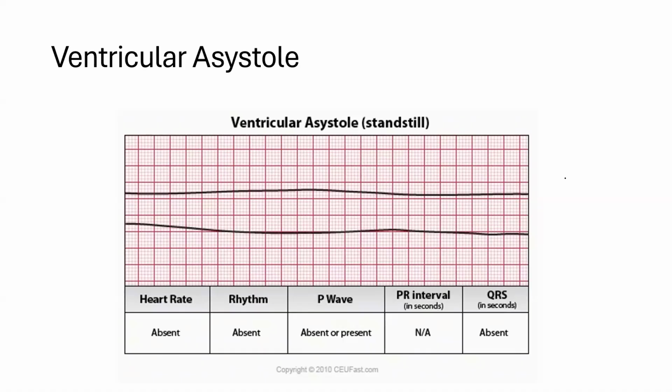Because he assumed that the patient was in asystole. Well, it stands to reason, if you have common sense, that if the patient is talking to you, the flat line might be because he was disconnected from the monitor, right? Oh my God, you would think so. But it happens. Please don't commit that error. You are going to embarrass me.